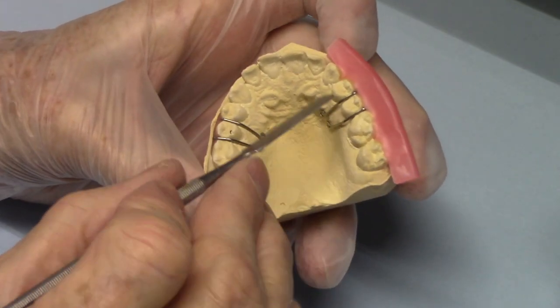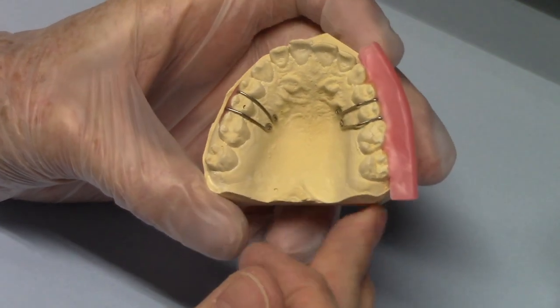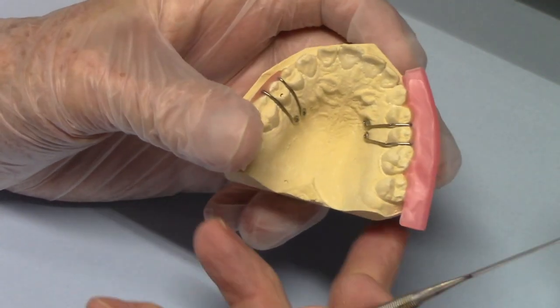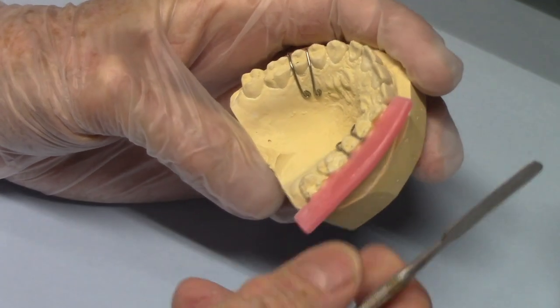Here's a model I bent some wires on. This is just for the video — this isn't a real case. One of the things I used to do is put a wax border on, and that's just a sheet of base plate wax. You can use utility wax or whatever.